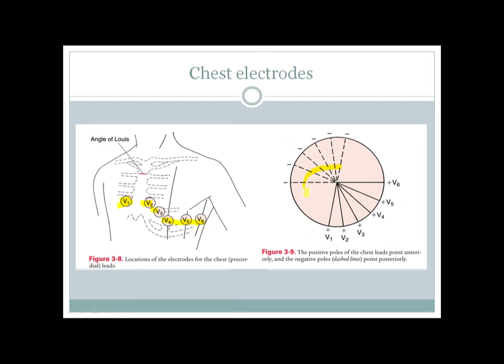Suppose this here is the heart, a cross section, and we are seeing the heart from multiple cameras or multiple views. Like this is a frontal or anterior view, and this generates a lateral view, and the other leads are in between. So we can see multiple parts of the heart from multiple different leads.